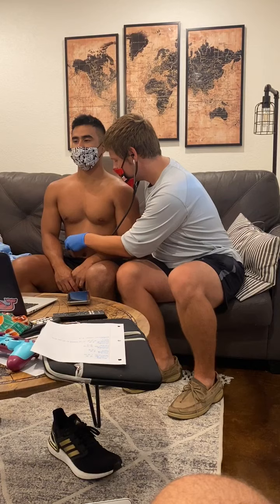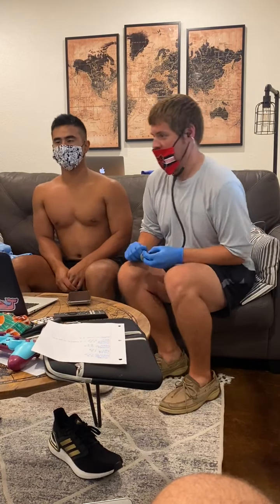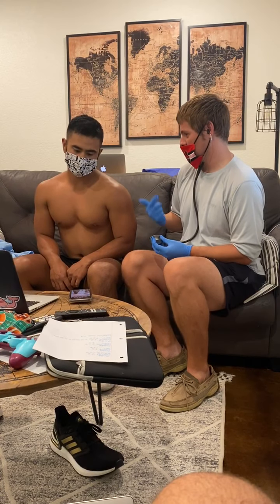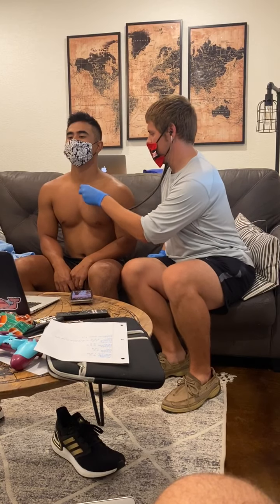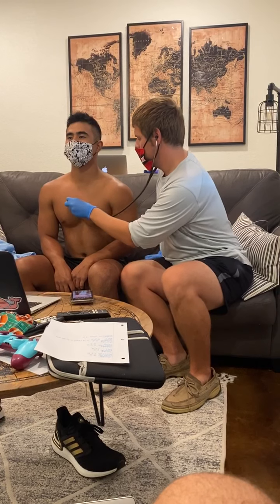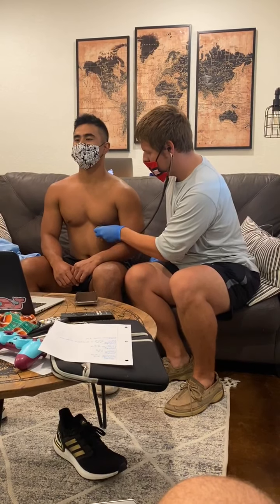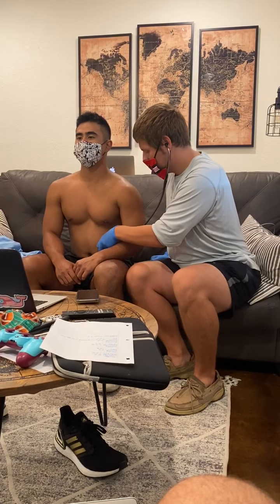99. Okay, next one we're going to be doing egophony, and we're looking for that E to A change. So we're going to say E, and hopefully it doesn't change to A when listening to it. Gotcha. All right. E, E, E.